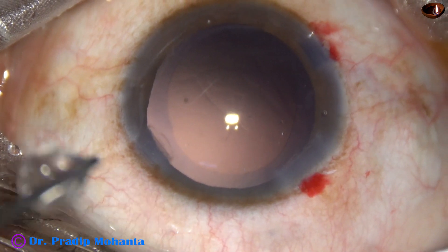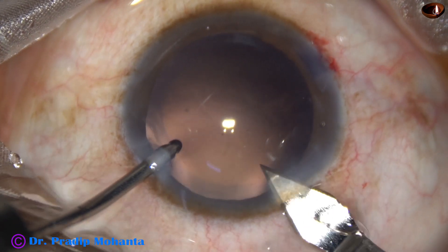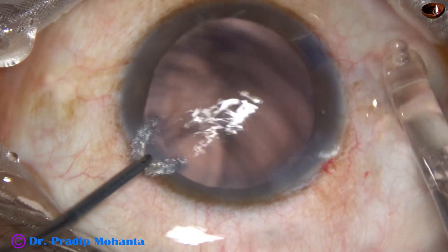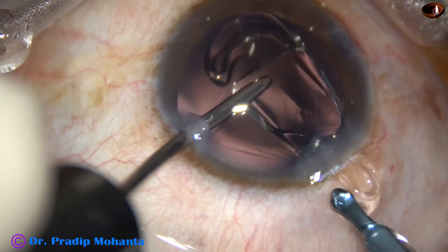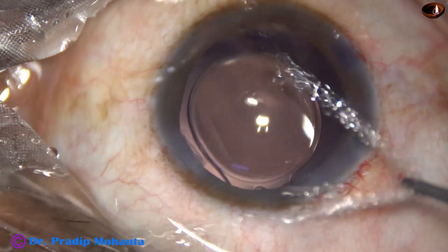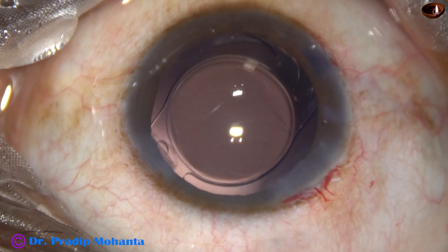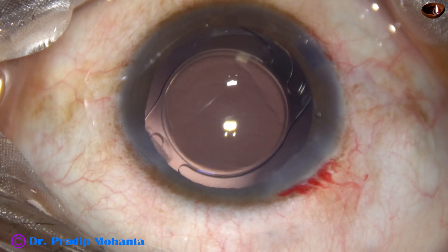Now, implantation of an intraocular lens. I am going to use a B-cutter, enlarging the main wound by 0.2 mm — the size of the wound is 3 mm now. The intraocular lens is inserted; the leading haptic goes into the bag and the trailing haptic is pushed into the bag by the left-hand instrument, which is the irrigating probe. The irrigating probe is also used to dial the lens — we can use a Sinski hook to dial the lens, but in this case I used the irrigating cannula.